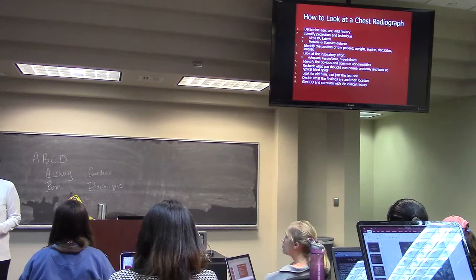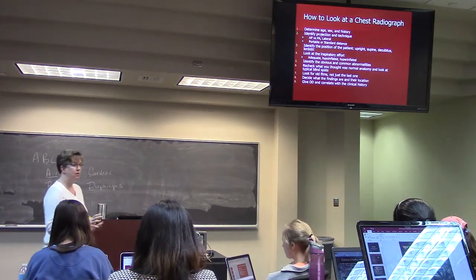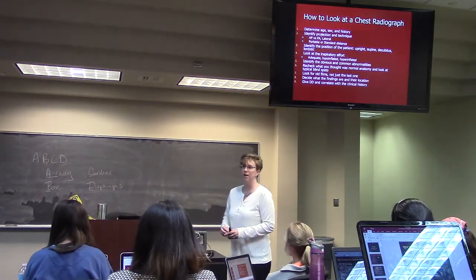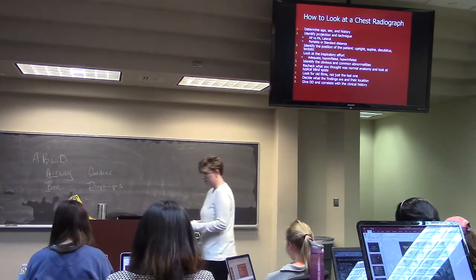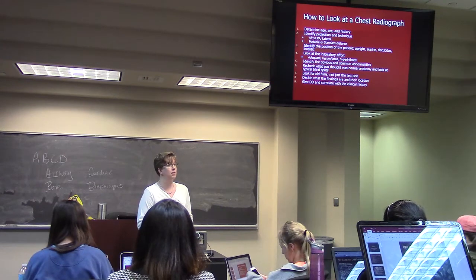had Dr. McNeil, and he talked about how to do an x-ray, how to interpret an x-ray a little bit, kind of how it all works. So that's kind of a good introduction. My job is to teach you how to read a chest x-ray today. So we're going to talk about that a little bit.